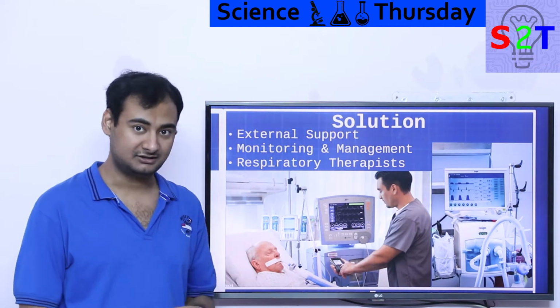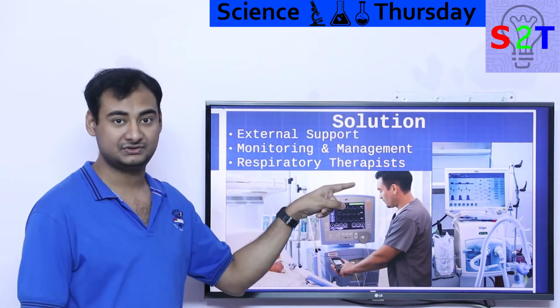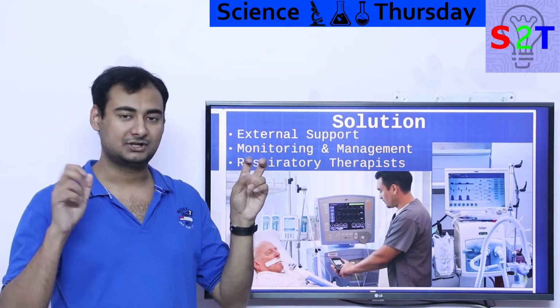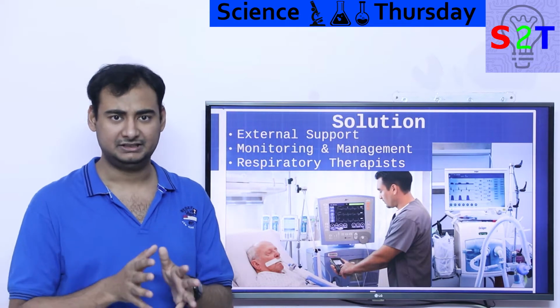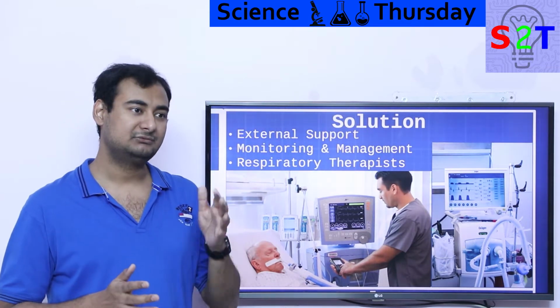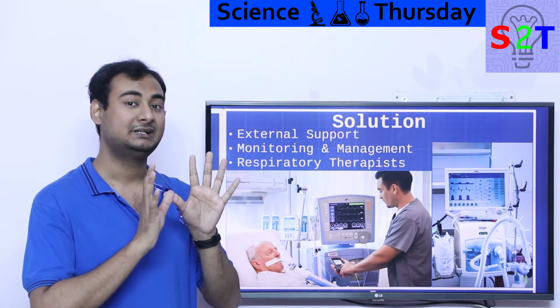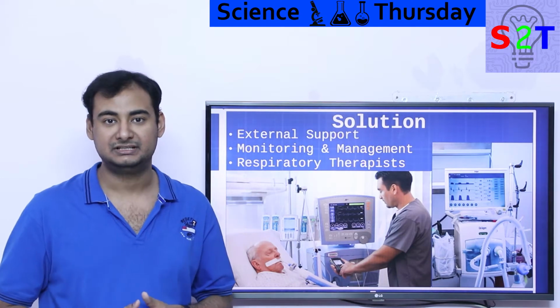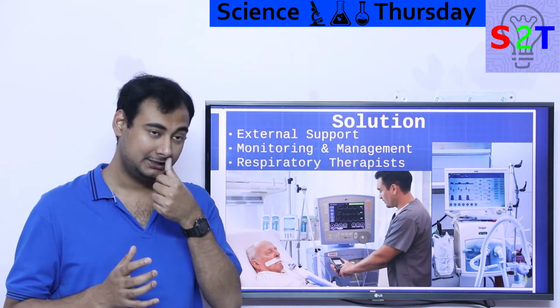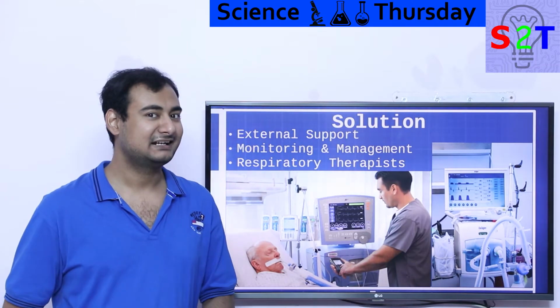Now the biggest hurdle with this system is, even though you can mass produce the machine, you need a respiratory therapist. If you are familiar with any operation series, or if you have been in an operation, you must have seen there are more than one person inside. One of them would be the anesthesiologist, whose sole job is knocking you out. Another person would be this guy, whose sole job is to make sure, because you are generally under general anesthesia, and if it's severe enough, it's gonna disable the muscle system that is operating your lungs. Lungs cannot go on vacation.